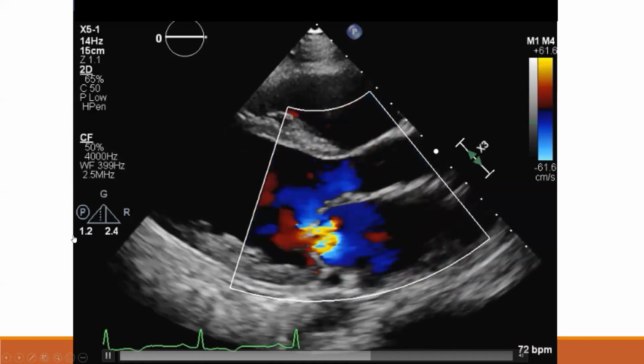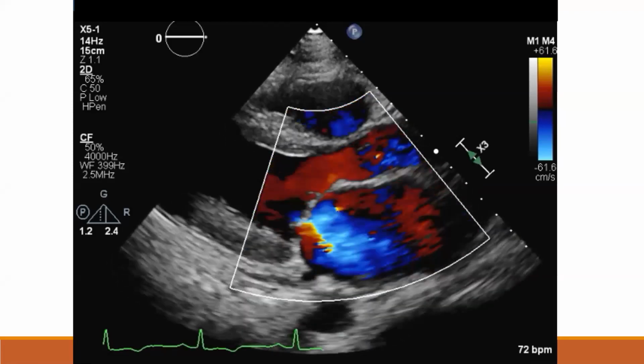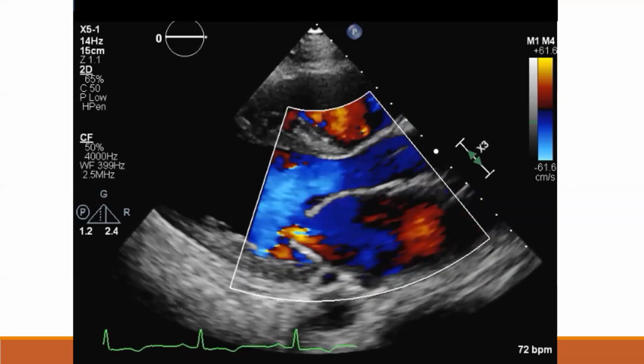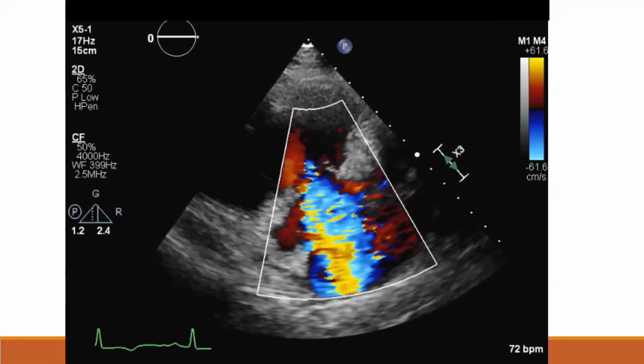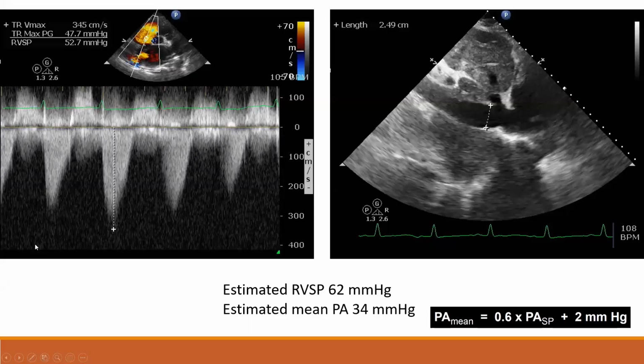After she converted to sinus rhythm, this was her echocardiogram. And you can see she has maybe mildly reduced LV systolic function, but she does have significant mitral regurgitation. She also has, probably worse, tricuspid regurgitation. And if we look at her non-invasive assessment of right ventricular systolic pressure, she has an estimated RVSP of 62. As you can see, the IVC is dilated. And using our equation, that gives us a mean PA pressure of 34, which is moderate pulmonary hypertension.